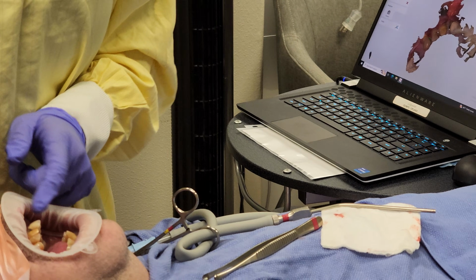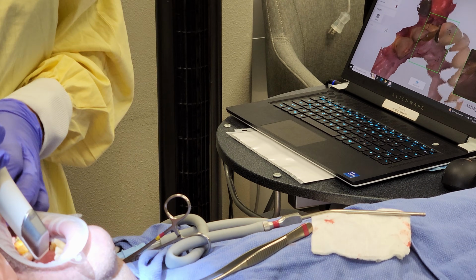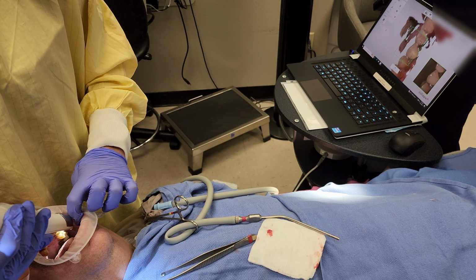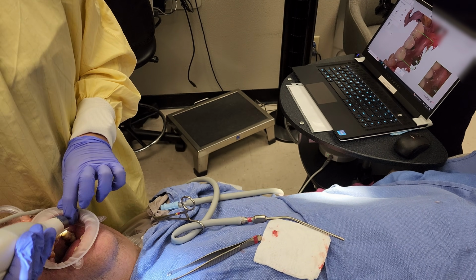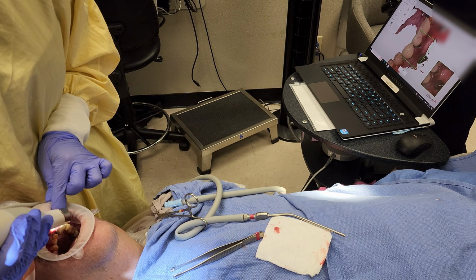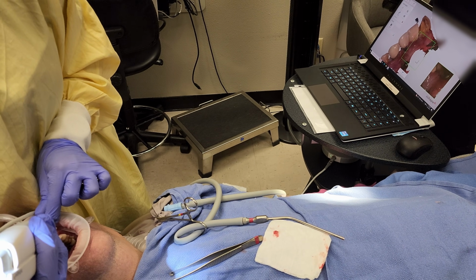go. Okay, so before we get into the surgery, something that's going to be important to know from here on out is that everything in the computer is digitally lined up in the software by structures that are solid. And up to this point, that solid thing that we're using to line everything up is the teeth themselves, because they're solidly in place. But those are going to be removed very soon. And so once those are gone, we need something else solid to line all these scans up in the jaw.